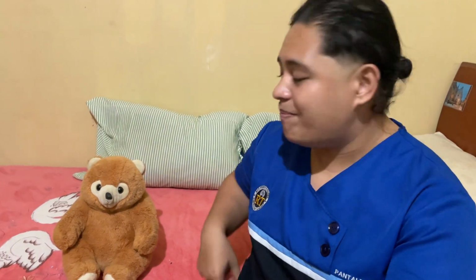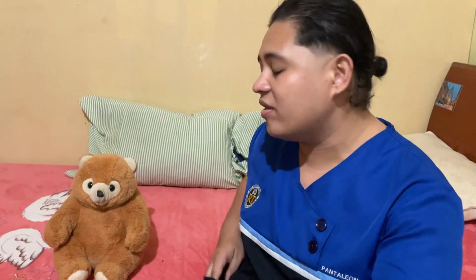Then, we should always document the time of the therapy, medication used, and patient's response to therapy. Note the tolerance of the treatment. A written summary provides an accurate documentation of the care and the patient's response to the treatment.